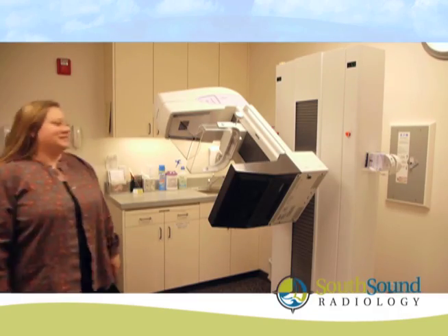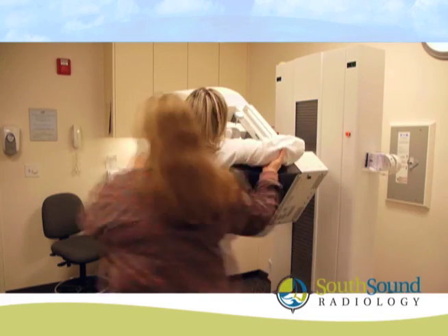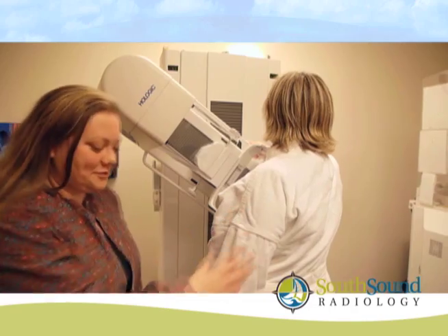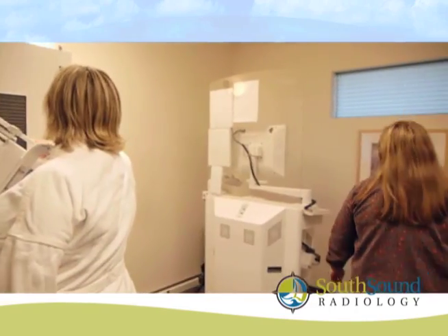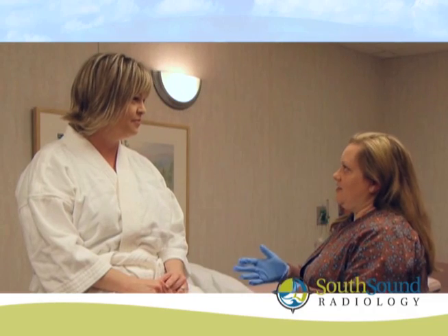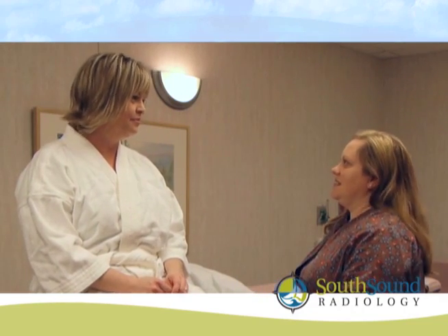Stitches are not required. You will then be escorted to the mammography room, where a gentle 2-view mammogram will be taken to document the location of where the biopsy samples were removed and to verify the location of the tissue marker. You may experience minimal discomfort following your exam. Some bruising and soreness is expected.